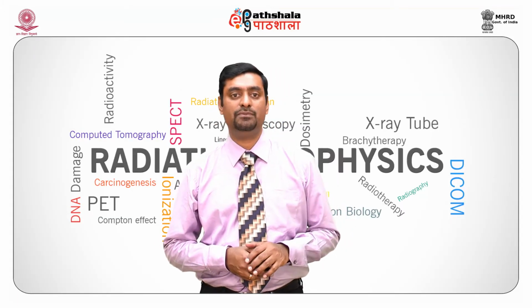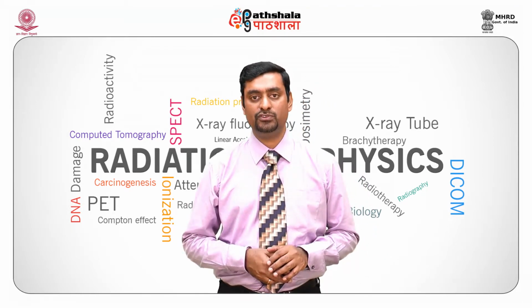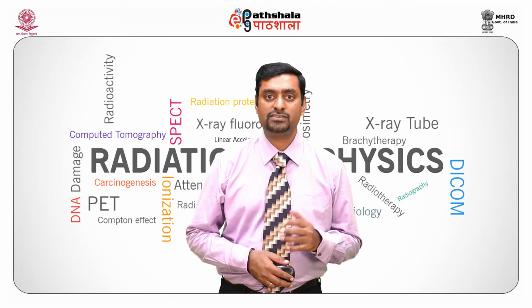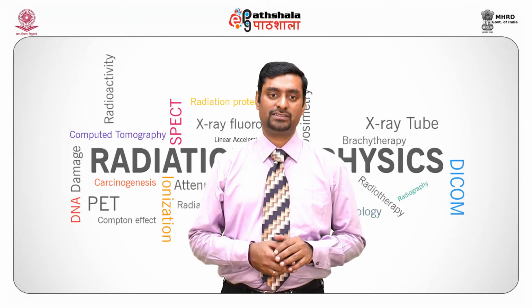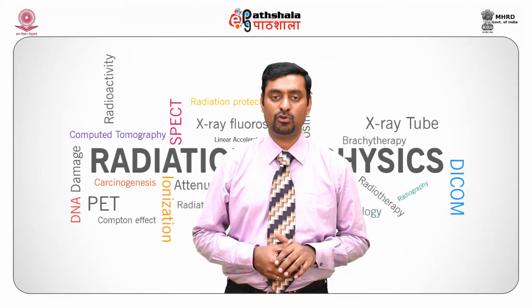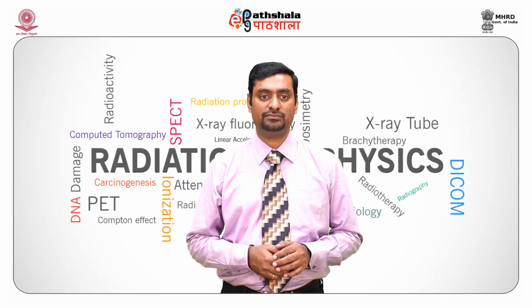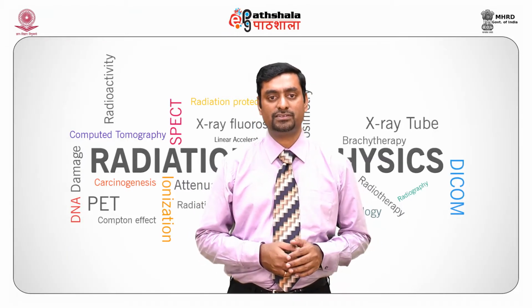Let us go on to the image detectors. Traditionally, film screen receptors were used. Later on, we moved on to digital detectors. There are various types of digital detectors that can be used in mammography. The various detectors are computed radiography, slot-scan acquisition CCD array based device, indirect conversion with scintillator and a thin film transistor, and direct conversion with a thin film transistor. These are the various digital detectors.